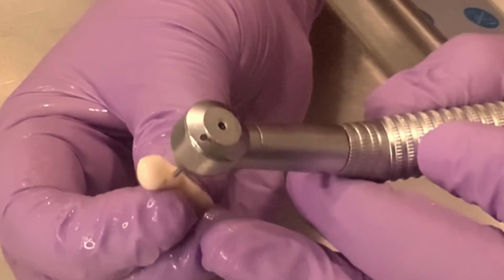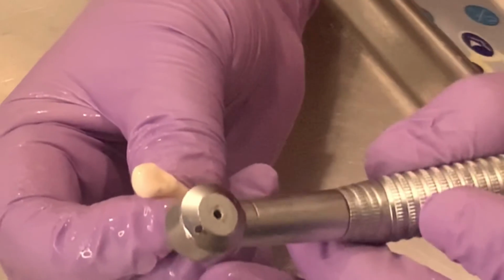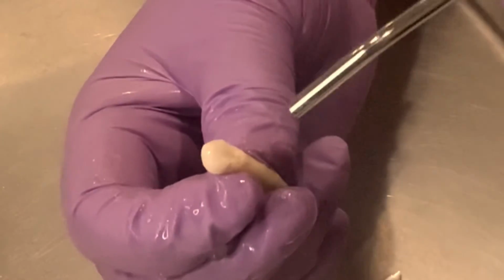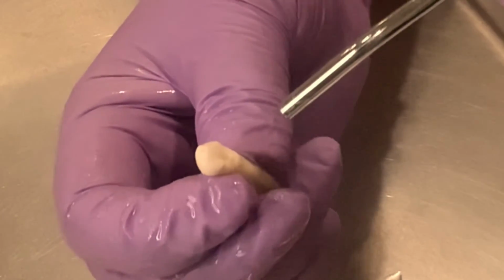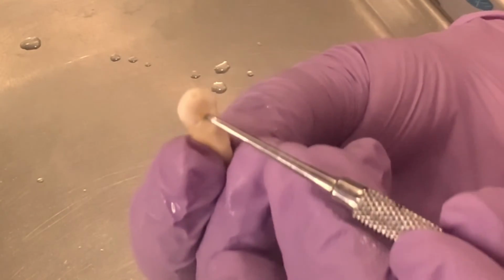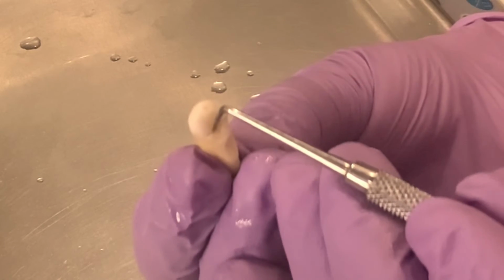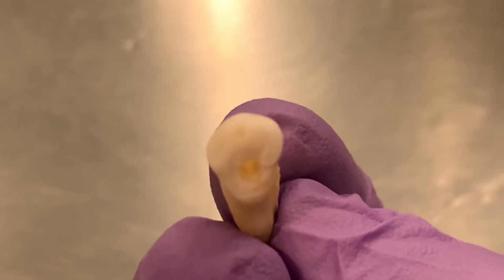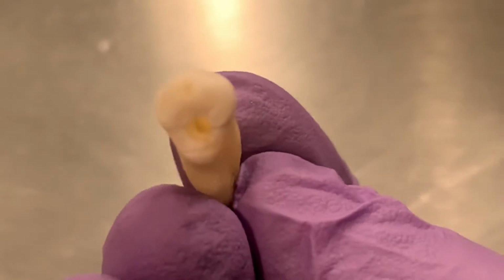You see, the shape of the access outline should reflect the shape of the internal anatomy of the coronal pulp chamber. And in this case, it is ovoid. Therefore, our access cavity is ovoid in shape. The straight probe shows a direct access into the root canal. In this position, you can even see the root canal orifice.